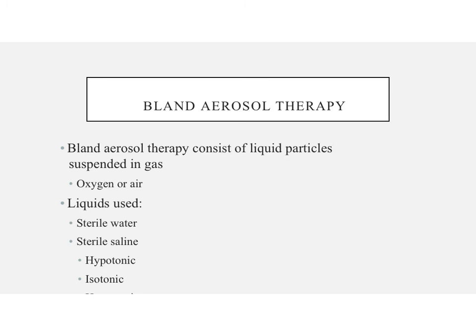So water vapor is smaller and it's not going to cause those droplets, whereas bland aerosol therapy is like it says, it's aerosol, it's liquid particles suspended in a gas, and we can use oxygen or air for this therapy. So the liquids that we use are sterile water or sterile saline. And sterile saline we can do hypotonic, we can do isotonic, or we can do hypertonic.